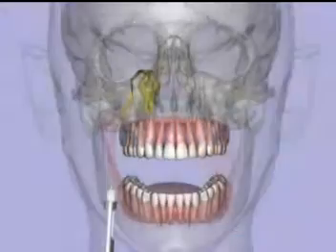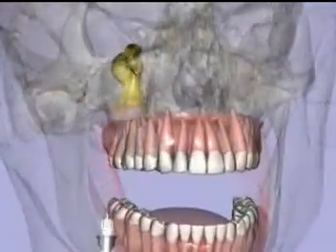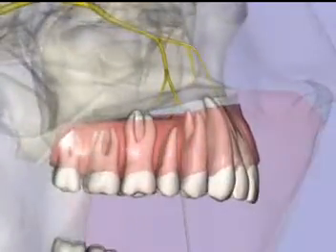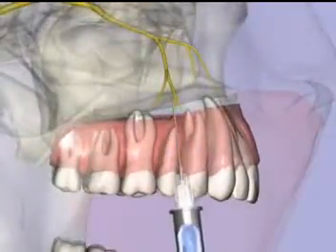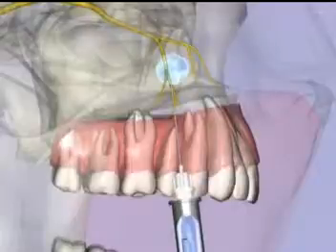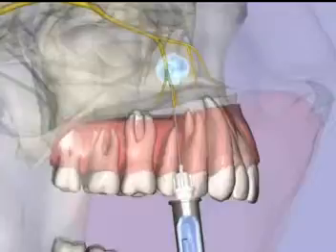Middle Superior Alveolar Nerve Block: Using a 27-gauge short needle, insert in the buccal fold above the maxillary second premolar, advancing the needle until its tip lies well above the apex of the tooth. Following two negative aspirations, a volume of 0.9 milliliters of local anesthetic is injected over 30 seconds.